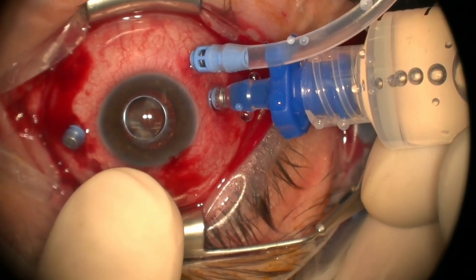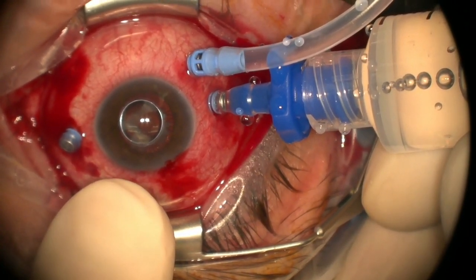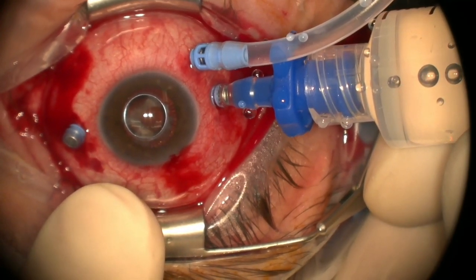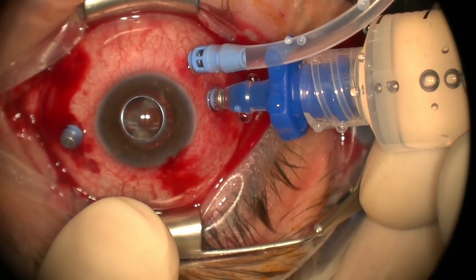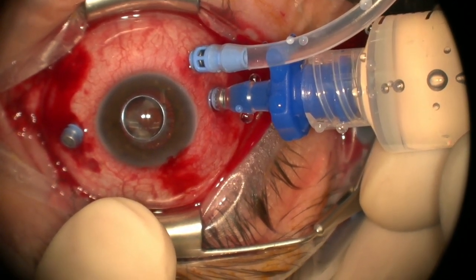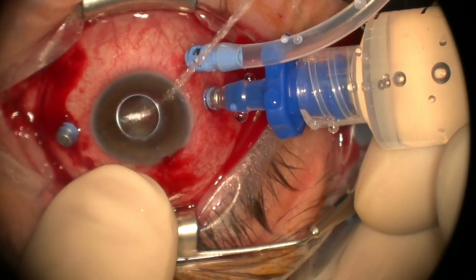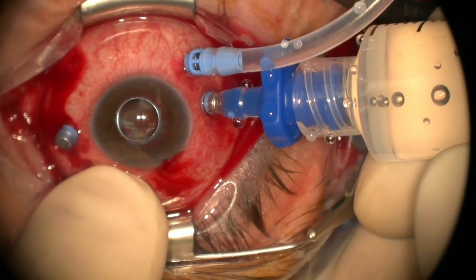Probably end up cutting the retina again if it's that severe and reattaching the retina and lasering things and perhaps even using more oil. But I'm hoping the case wouldn't go that way. I'm more optimistic we can just take the oil out, peel the membrane, leave the eye with balanced salt solution after we check the peripheral retina well, make sure there's no open retinal tears or breaks. And we're probably around 4 cc's now for oil out. And again, the eye may be a little large, so it's going to take us a little time.